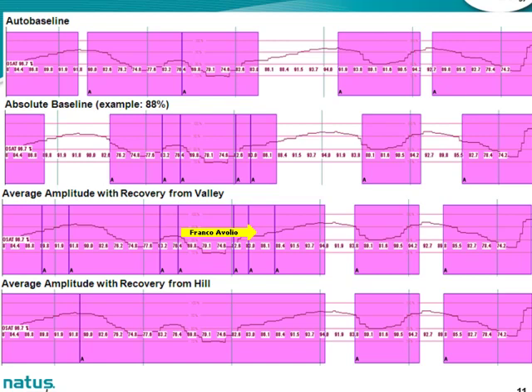The analyzers aren't 100% perfect by any means, and this is why we've got varying success rates with the analyzers. In general, the success rates of all the analyzers vary, I believe, from 60 to 80, I think as high as 88%. So it depends. And when you see something like this, like I said, it's comparing it to an amplitude value that was computed using data from several minutes back. And so that's why you start to see stuff like this.